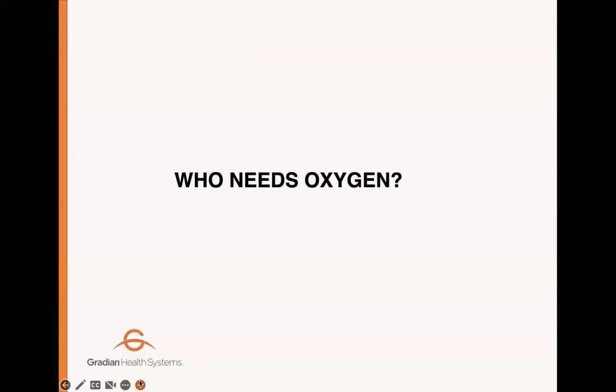So who needs oxygen? As I said earlier, oxygen is a drug. It should not be given to everyone. If this person is hypoxic, then just give oxygen. But you should understand why they are hypoxic. From all four types of hypoxia, it will help you to know what appropriate method of oxygen, what amount, and what delivery device you should use.